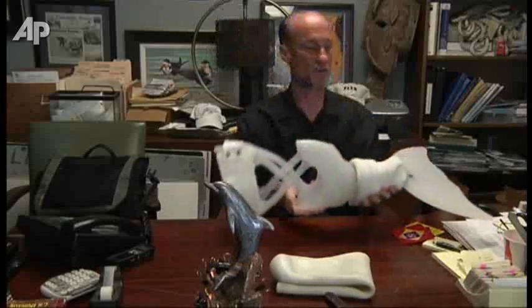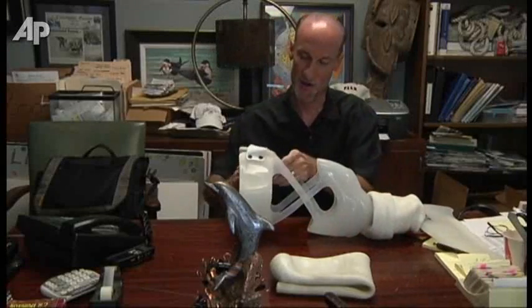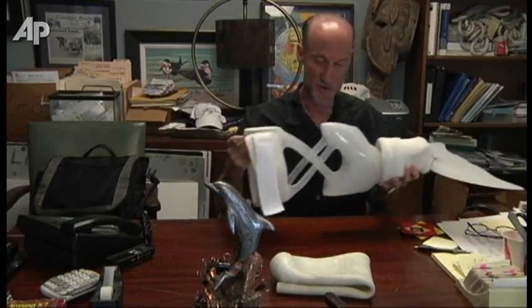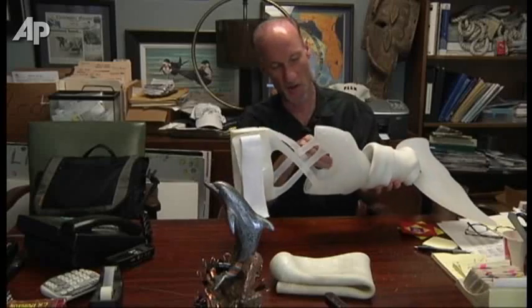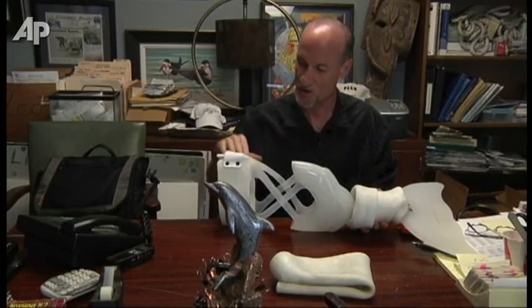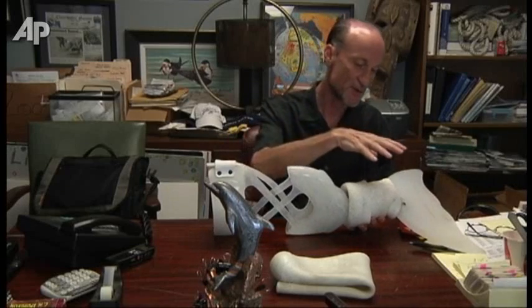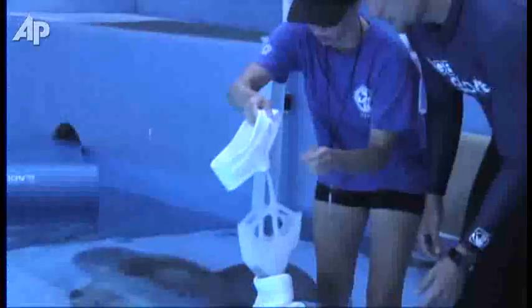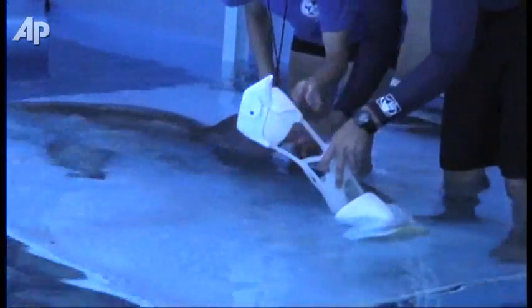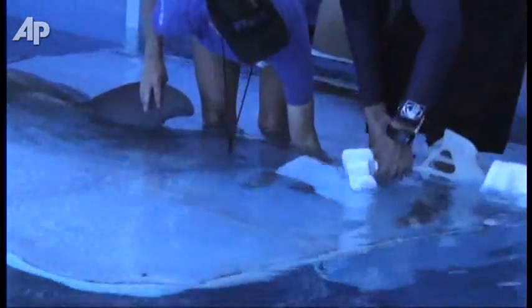This is a little high-tech device called Velcro here. And we'll take this — her body will slide right in here. This is again to mold her body; it'll fit, it'll be nice and snug. We'll tighten this to whatever size she is that day because she isn't stopping growing. This is another sleeve of Winter's gel just like this. It's not wet right now so I can't roll it over, but this rolls all the way over the top and that's how it stays on.